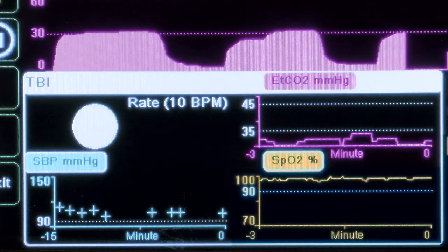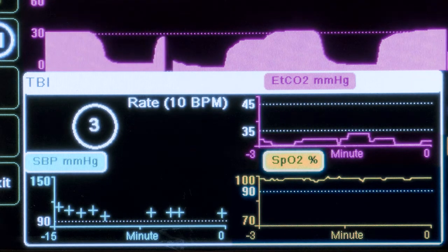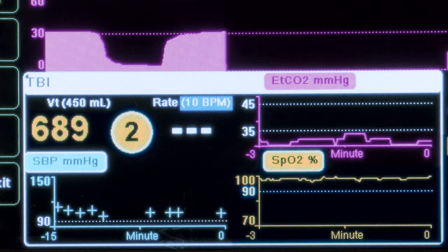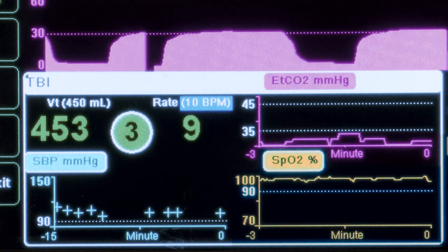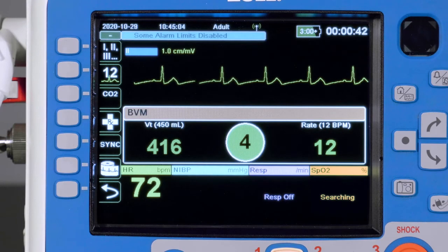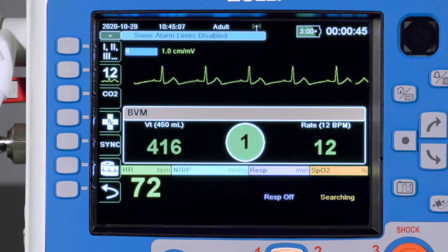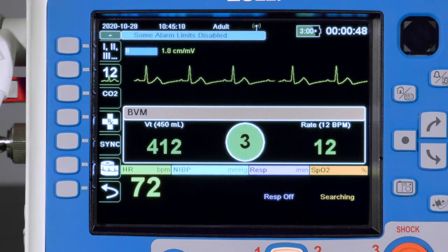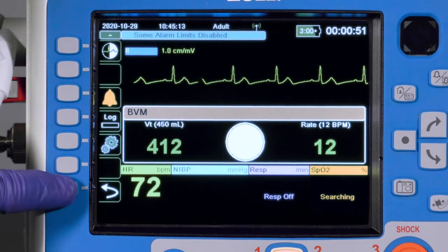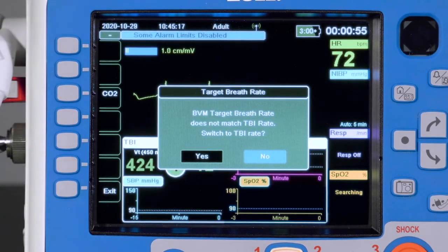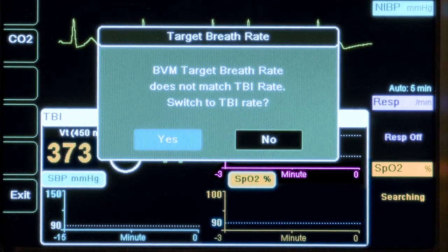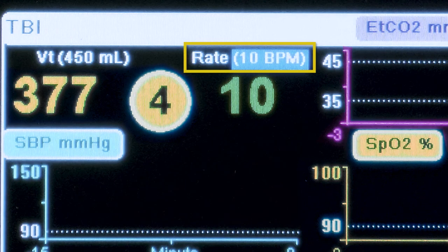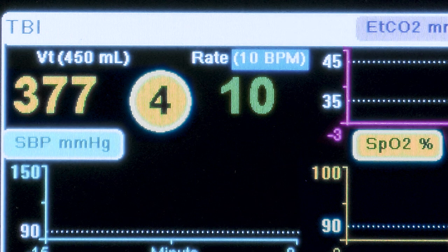If Real BVM Help is also being used, the Real BVM Help dashboard will populate in the upper left quadrant of the TBI Dashboard, replacing the simple ventilation timer. A default TBI ventilation rate is configurable at the supervisor level. Note that if Real BVM Help was already in use prior to entering the TBI Dashboard and the target ventilation rate does not match the default TBI ventilation rate, the provider may see a message stating: 'BVM target breath rate does not match TBI rate. Switch to TBI rate?' Responding yes will switch the target ventilation rate to the TBI default rate. Responding no will leave the target ventilation rate as currently set in the Real BVM Help dashboard.